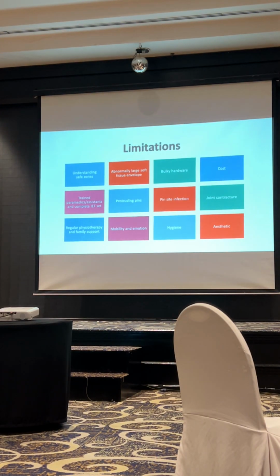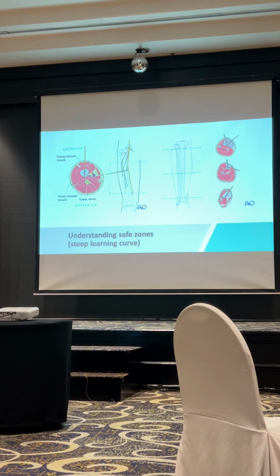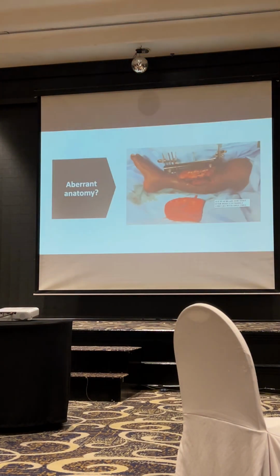So the last part is the limitations. There is a long list of limitations. There are complications as well, but those will be explained by another surgeon. The limitations that you will encounter doing Ilizarov: the first one is understanding the safe zone. Not every Tom, Dick, and Harry can do Ilizarov, but understanding the safe zone is paramount, because you have to understand that the learning curve is a bit steep.